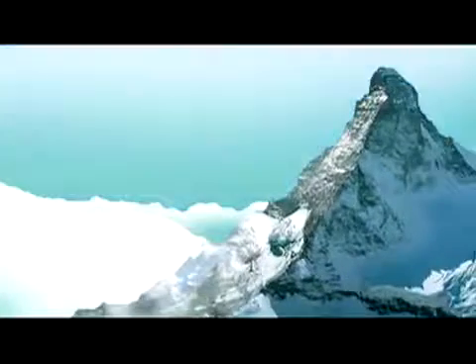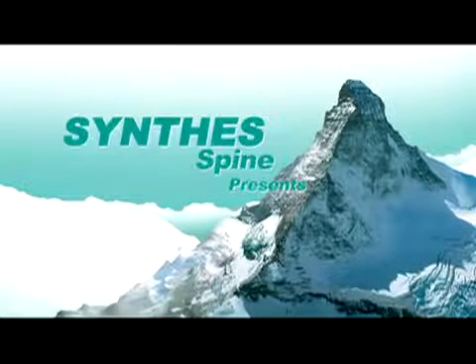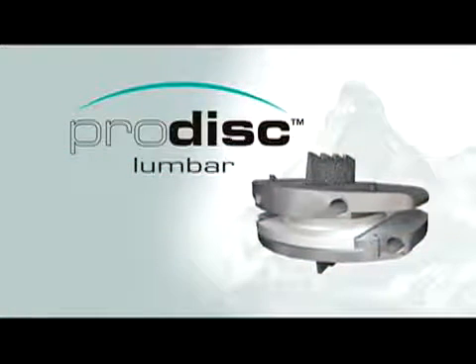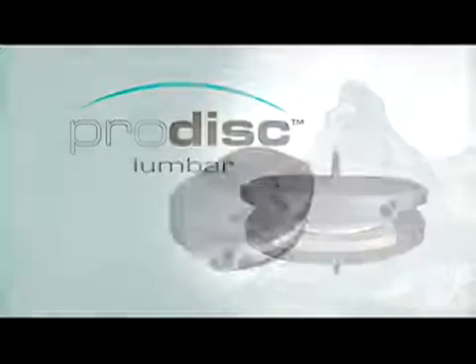The ProDisc-L Total Disc Replacement from Synthes Spine is designed to reduce pain, preserve motion, and improve patient function in patients with degenerative disc disease at one level between L3 and S1.